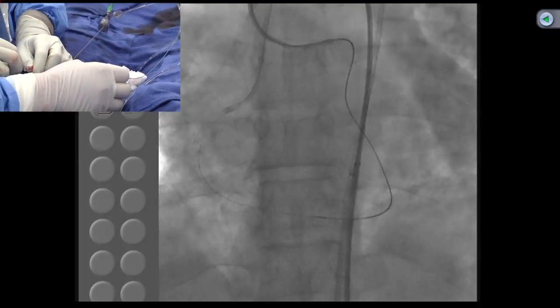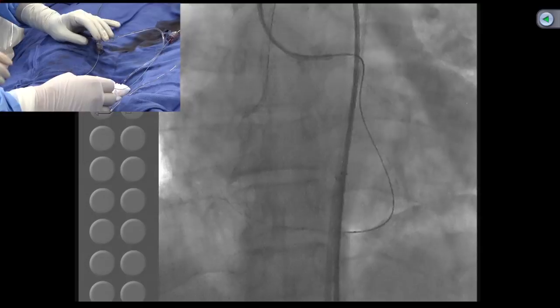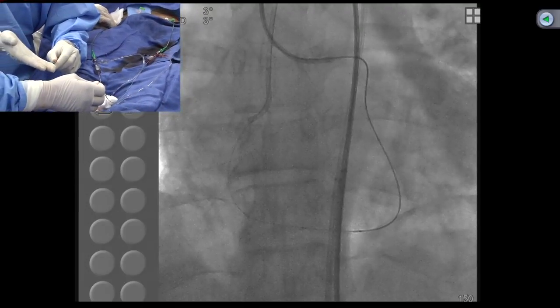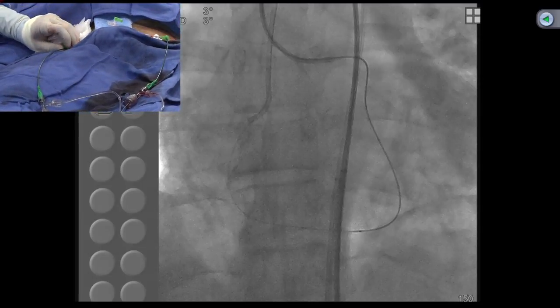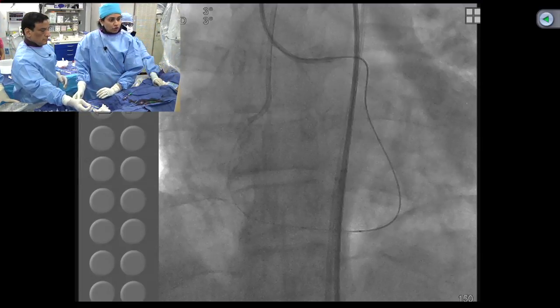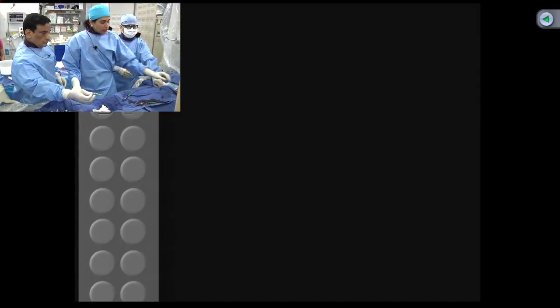This is another important technique that I want to show. Normally taking the stainless steel hardcore Viper wire through the circle that has been created could be dangerous, in the sense you could slice the artery when you're pulling it out. So you have to be careful. This is the technique that we want to show, which is called the kissing.